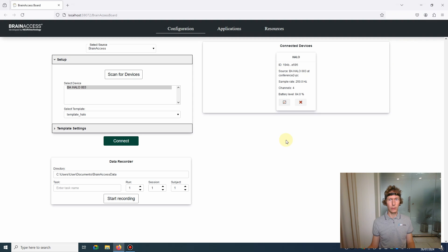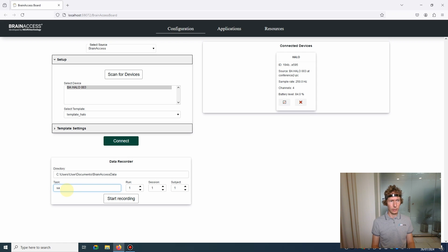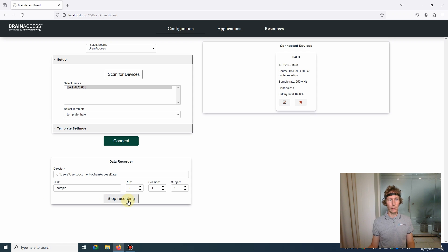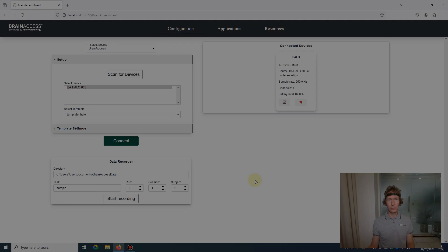Once we check the signals, we can go straight ahead and record data. Give a name here and press start recording. After you finish, just press stop.